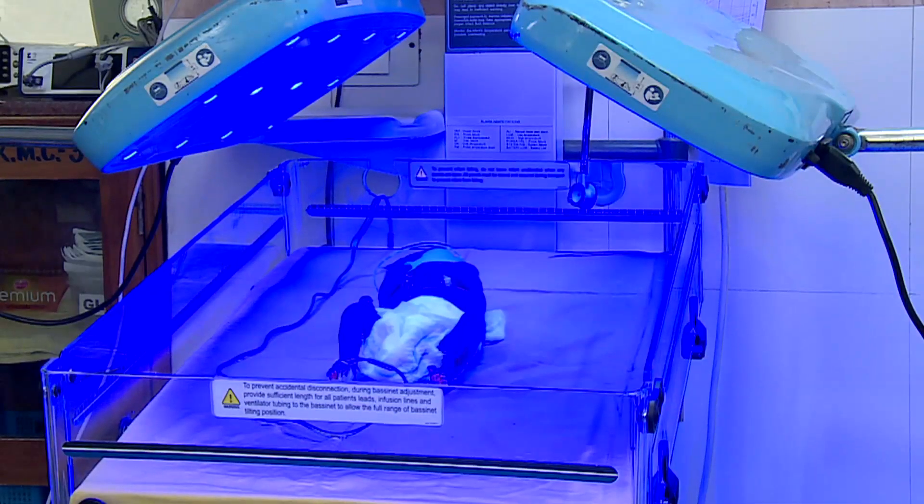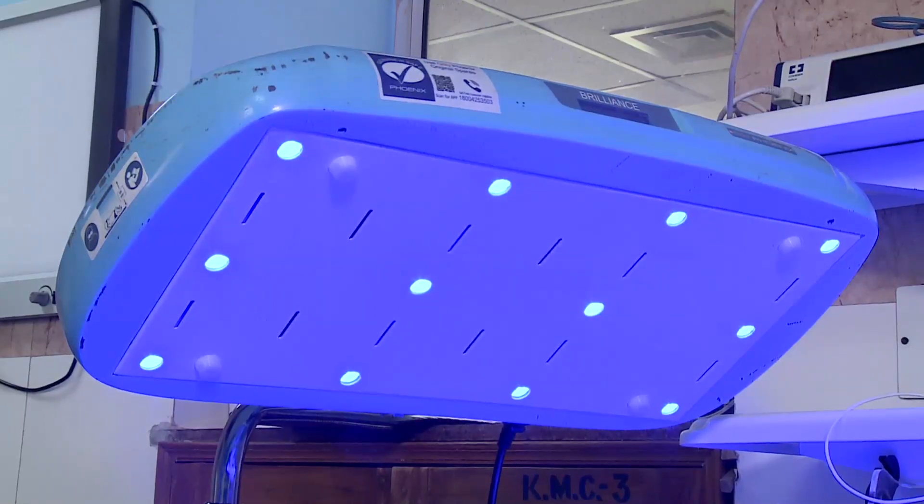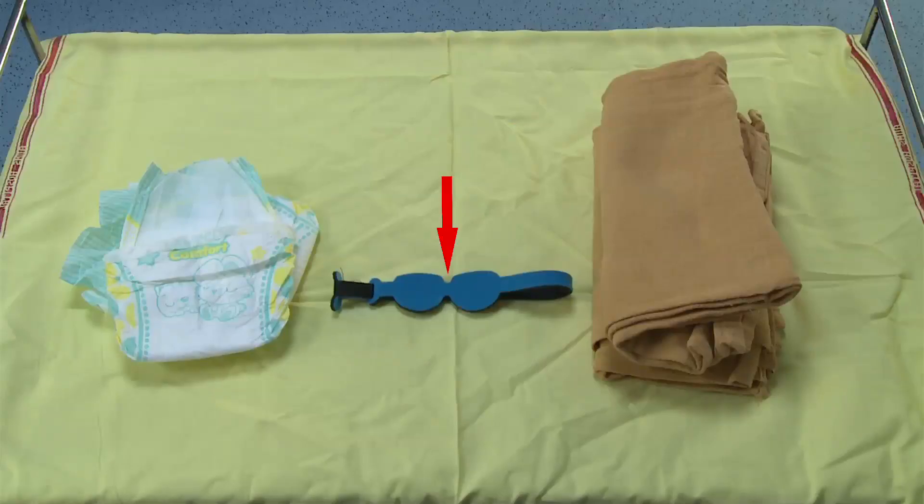In this video we shall see how an infant is cared for while under phototherapy. One would usually require a phototherapy unit with light sources, which could be LED, compact fluorescent light, or CFL, eye shields of appropriate size, nappy, and extra linen.